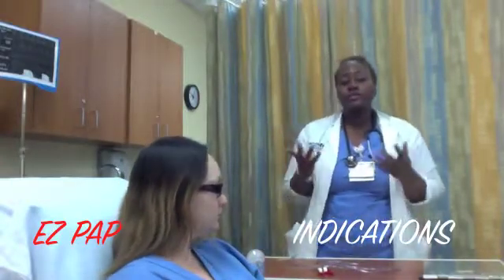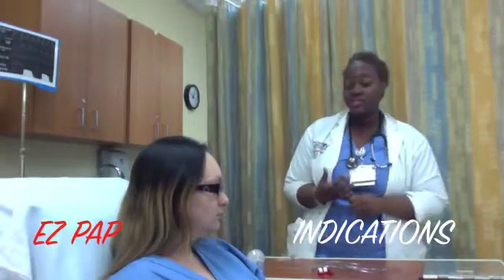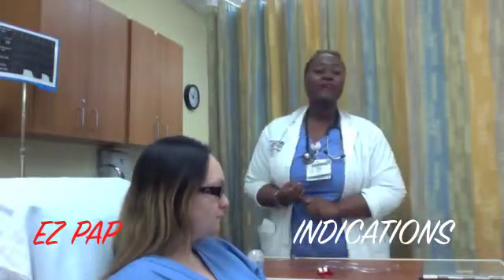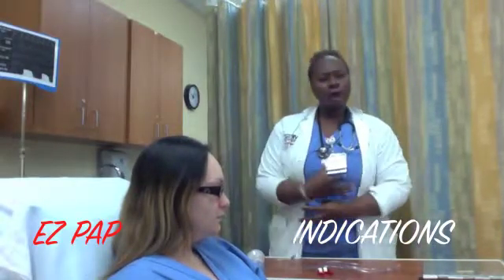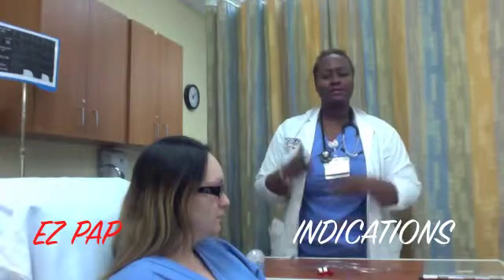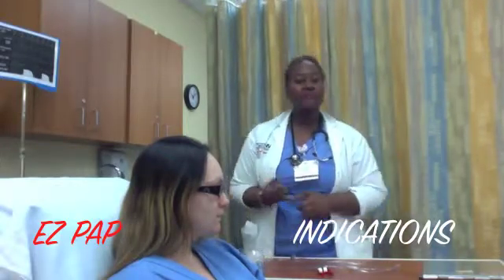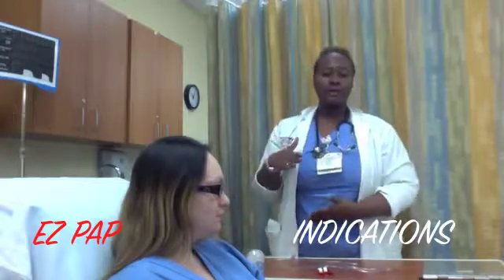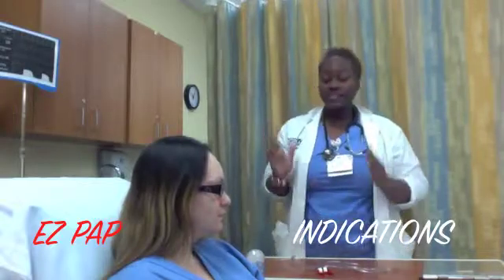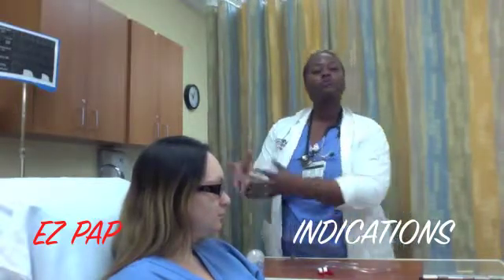The respiratory therapist should know that the indication for this therapy is great in patients with cystic fibrosis or chronic bronchitis who have a problem mobilizing their retained secretions, as well as patients who have asthma or COPD who have air trapping. This therapy is also great in preventing and/or reversing atelectasis.